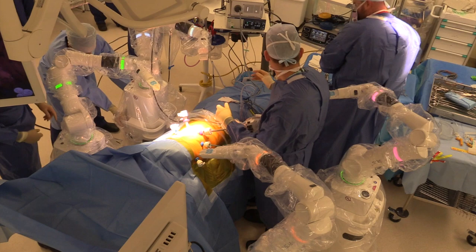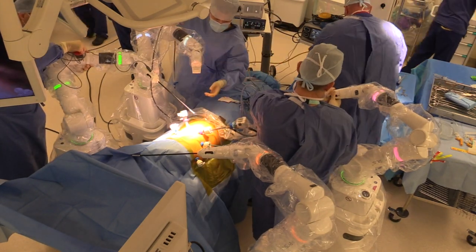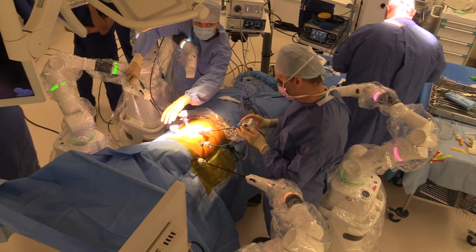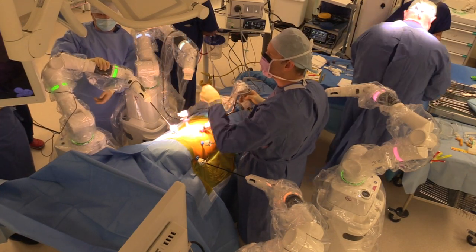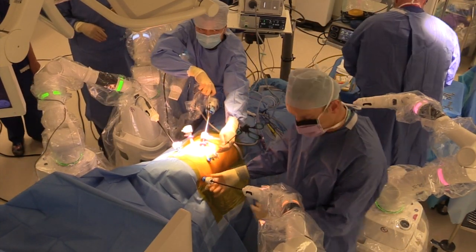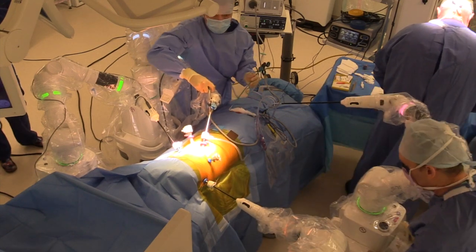Setting up the instruments — it was a very efficient team. We click on the Maryland bipolar diathermy, it goes to your own energy unit with no special energy units needed, and then two graspers. We pop them in the chest. The way you tell the robot where the chest is by doing a quick circular movement called port training — just a few quick motions of the arm and it knows where the skin is and will keep that still. I'm now port training the third arm here — just a quick rotation — and it now knows exactly where the skin is.